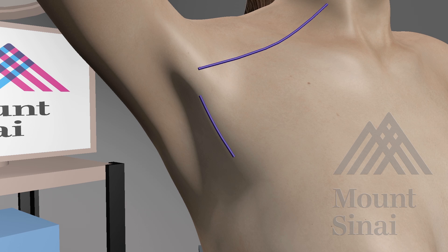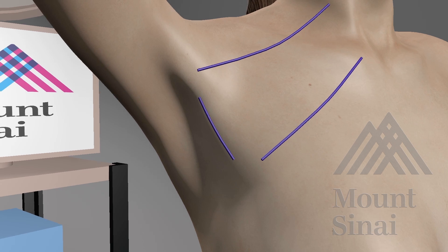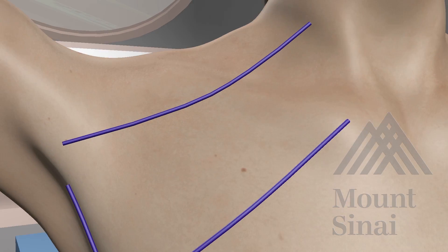We also mark guidelines for the cutaneous pocket that will be created in order to access the thyroid lobe. The transaxillary approach to a thyroidectomy is an alternative to the traditional cervical incision and has a greater cosmetic benefit of leaving no visible scars on the patient's neck.